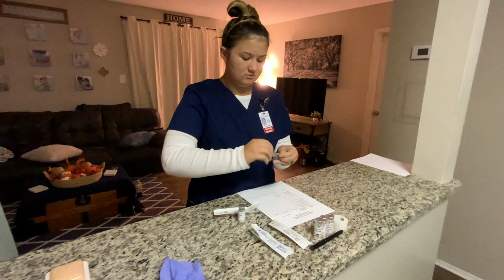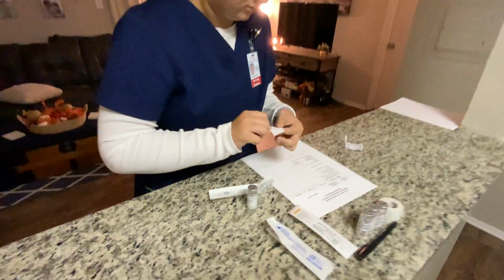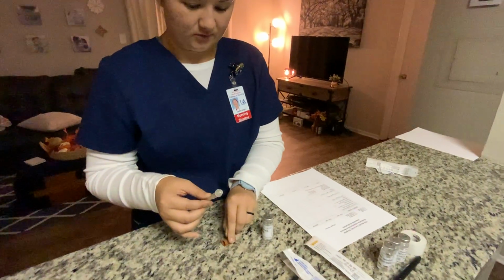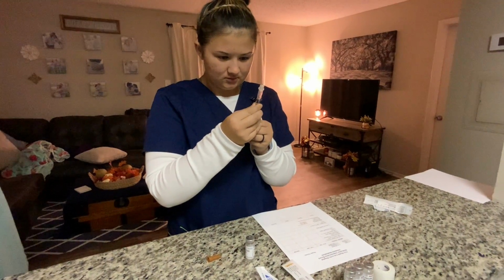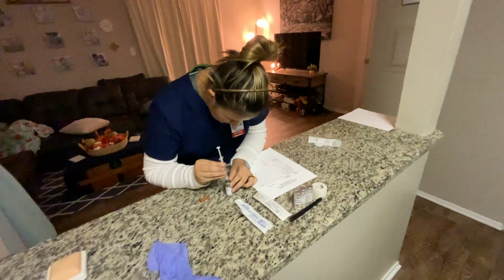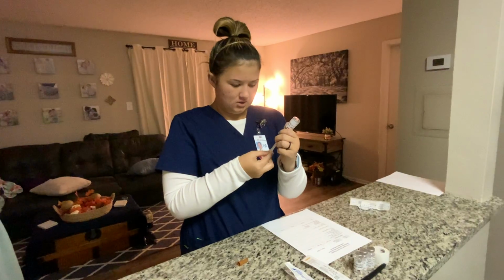The first thing I'm going to do is clean my vial. I'm going to clean from the innermost part to the outer. Throw that away. Then I'm going to get my TB syringe out. Take the cap off. I'm going to pull back 0.5 milliliters of air because that's how much medication I need. And there's my 0.5. So now I'm going to administer the air, and now I'm going to pull back on the medication, getting 0.5.